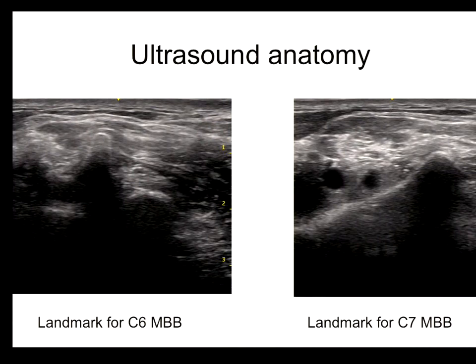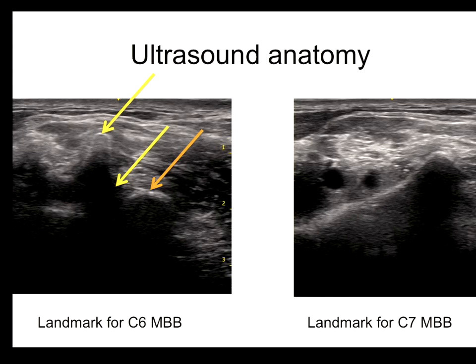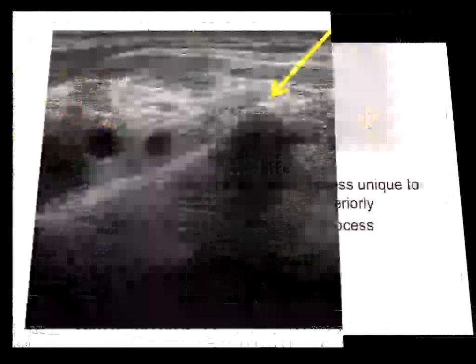This is the typical ultrasound anatomy of C6 and C7. At C6 you can see the typical shape of anterior and posterior tubercle with a gap behind the posterior tubercle, and you can see the last prominence of the articular pillar posterior to the posterior tubercle — that is the target for the C6 medial branch block. When scanning the C7 transverse process, you cannot see any anterior tubercle, only the transverse process. The upper edge of the transverse process is the target for the C7 medial branch block.